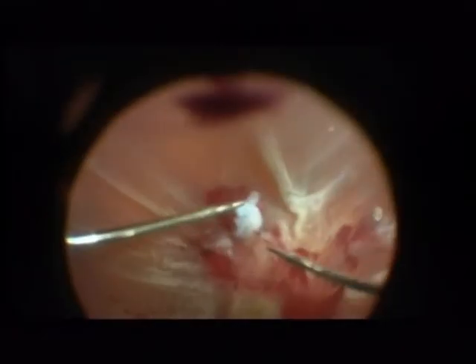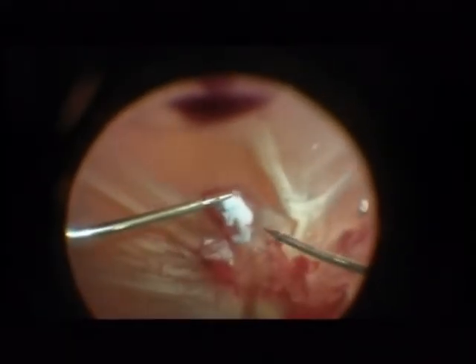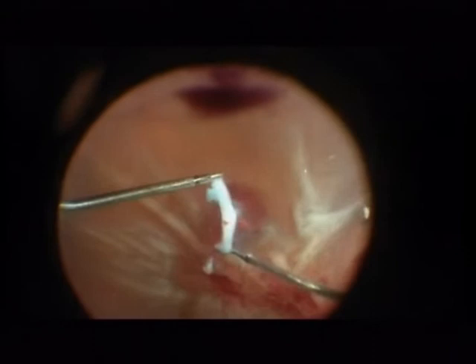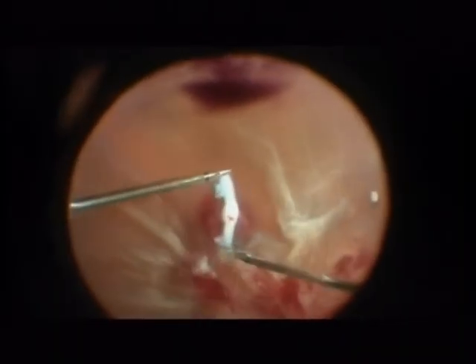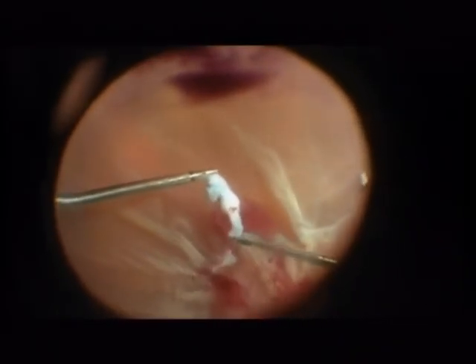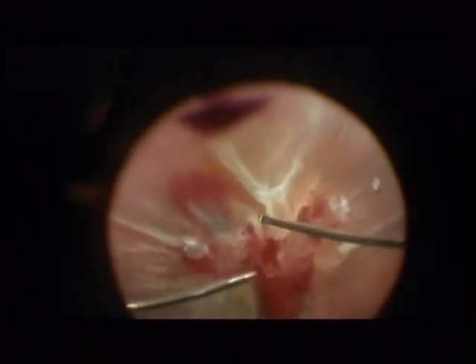In this case, this membrane you might be able to leave, because the traction from the other piece has been removed. Before you create major retinal ruptures, I recommend leaving the membrane inside the eye — only trim it.